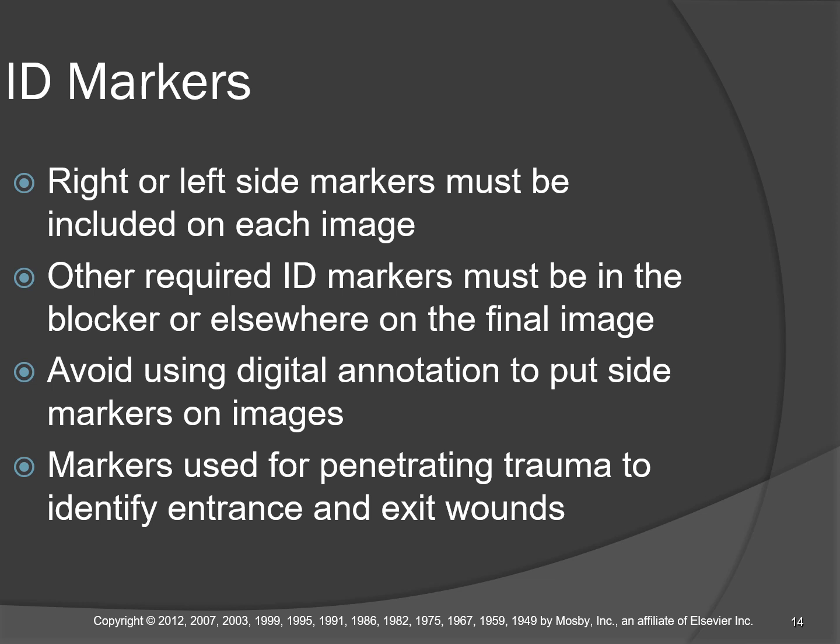Now, in the digital age, it doesn't cost anything to make a duplicate. So I would send one unmarked if you were going to mark the entrance wound. Let's say the person got stabbed, the knife was removed, and you want to indicate to the radiologist where the soft tissue knife wound was.